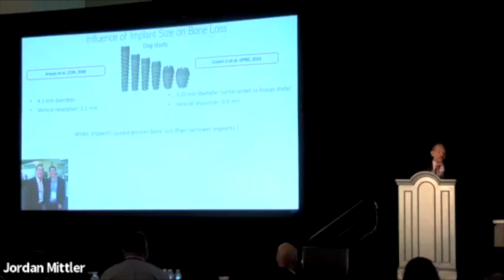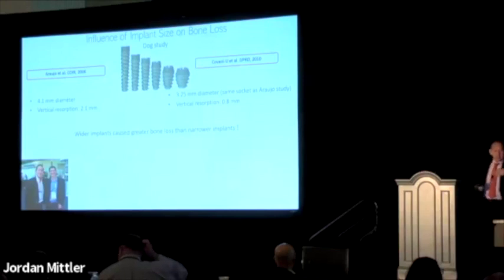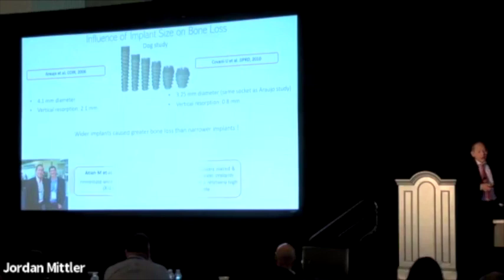This is Momi Anate, the guy that I quoted earlier. In 2011, I think it was, I was lecturing in Australia at the New Zealand Australia Academy of Osseointegration, and he was getting his PhD. He went to all the companies and asked them to give him all the wide implants. This was back in those days when they just started coming out with the fat boys, the 7 millimeter implants, all the Megagens and all the big implants. It was considered to be probably a good thing. So he went to all these groups and did this PhD study. And what he found was that the conclusion was completely opposite.